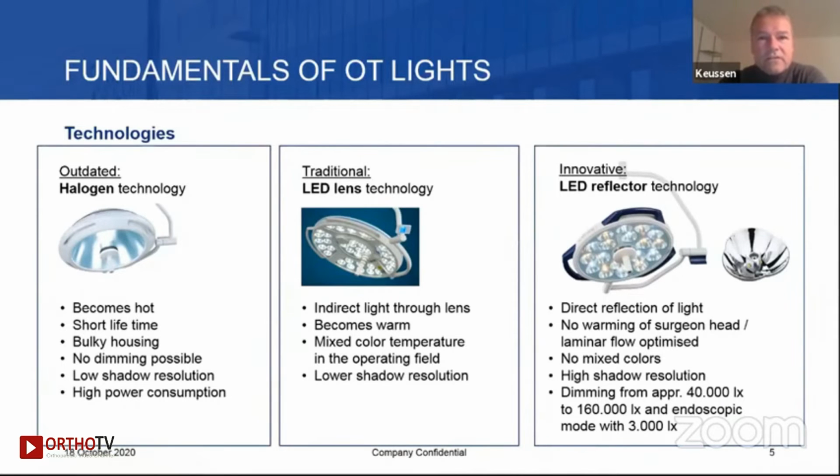There are a couple of technologies. You may all know the halogen technology, which is from today's technical point of view outdated. The halogen bulbs become very hot, especially your head below a light becomes very hot. They have a very short lifetime, which is only 1/5 to 1/6 of an LED.